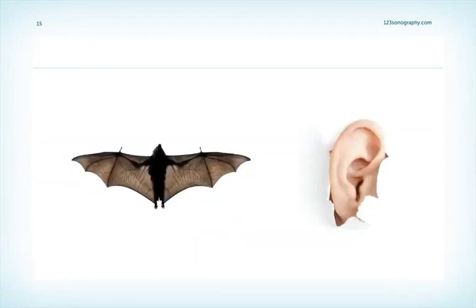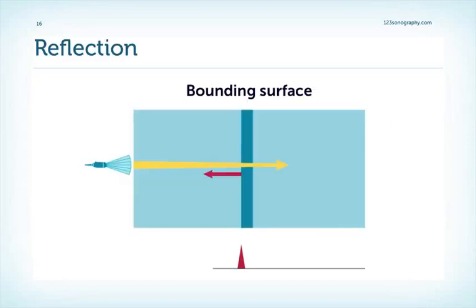But coming back to our bats and to why ultrasound works, well, it only works because the ultrasound wave is reflected. And reflection occurs if we have different tissue characteristics. Here, for example, the ray is reflected, and part of the ultrasound wave then penetrates further into the tissue.